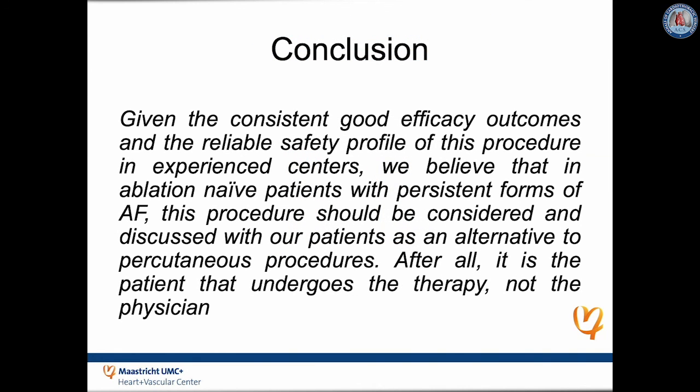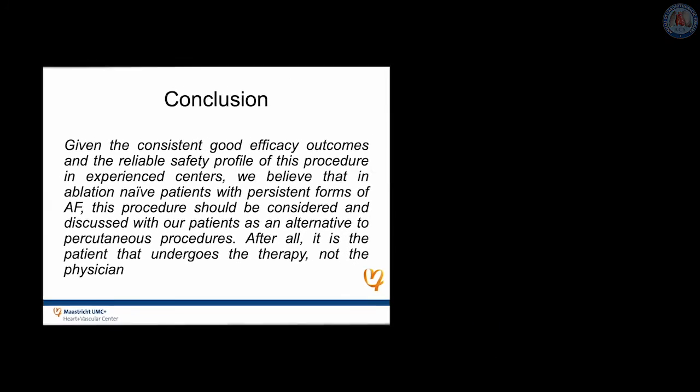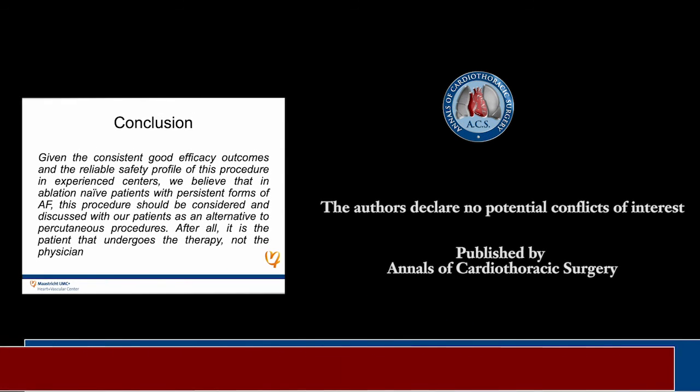So given the consistent good efficacy outcomes and the reliable safety profile of this procedure when performed in experienced centers, we believe that in ablation-naive patients with persistent forms of AFib, this procedure should be considered and discussed with our patients as an alternative to percutaneous procedures. Because after all, it is the patient that needs to undergo the therapy and not the physician.